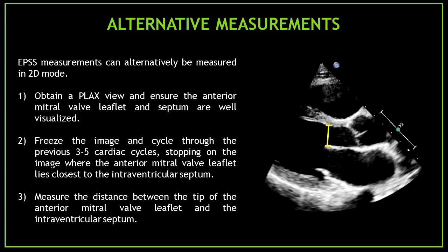Did you know that you could use an alternative measurement? The E-point septal separation is traditionally measured with M-mode, but can alternatively be measured on 2D-mode. Three simple steps: Number one: obtain a parasternal long axis view and ensure the anterior mitral valve leaflet and septum are well visualized. Number two: freeze the image and cycle through the previous three to five cardiac cycles, stopping on the image where the anterior mitral valve leaflet lies closest to the interventricular septum. Number three: measure the distance between the tip of the anterior mitral valve leaflet and the interventricular septum, as you would on M-mode.